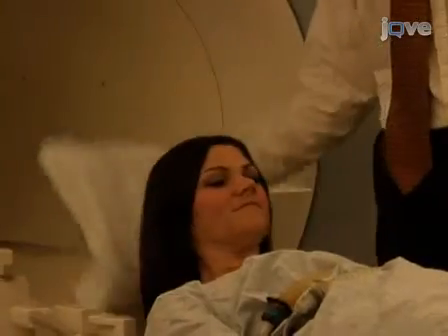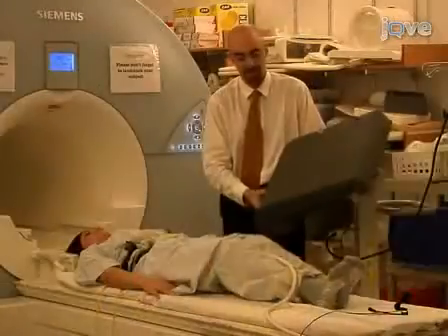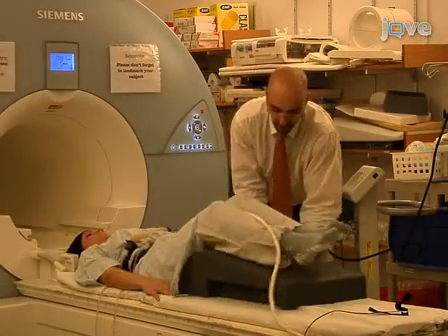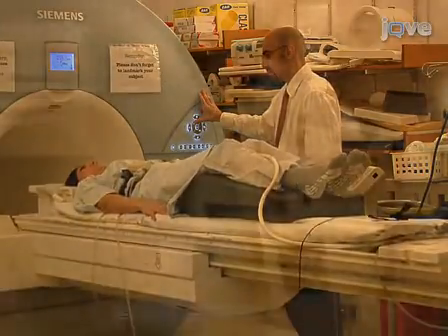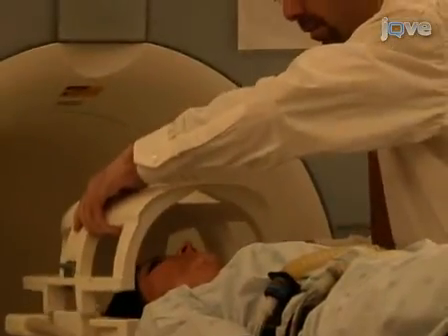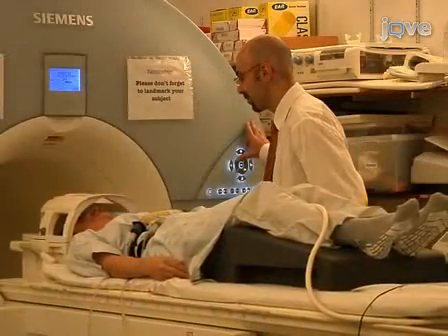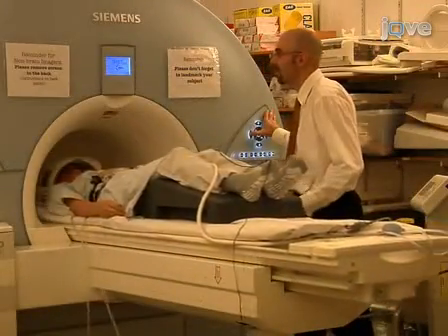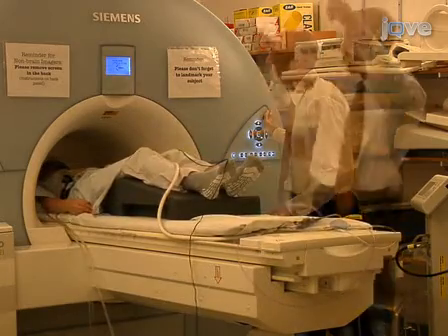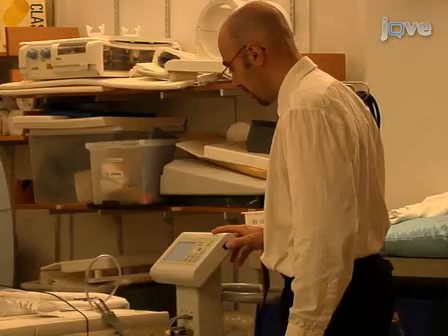Acupuncture scans are especially susceptible to head motion artifacts because of their low signal-to-noise ratio. To reduce body motion, place a support under the subject's knees to keep the heels from touching the surface of the stretcher. Fasten the head coil and make final adjustments to the support cushions to ensure that the subject is comfortable. Because an average session lasts 2 hours, comfort is vital for uninterrupted scanning. MRI-compatible physiological monitoring can be performed during scanning if desired. ECG signal quality should be verified before recording.